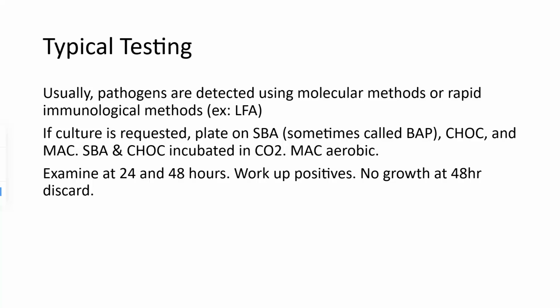Sometimes, though, physicians will order a respiratory culture. And a lot of times, like I mentioned previously, these are going to be sputum cultures, or if a patient has been on a ventilator or an indwelling respiratory device, maybe we'll order something like a swab around that device to check for biofilm formation or to check to see what organisms might be growing in there. Because the longer we have indwelling devices in the body, the more likely we are to develop those types of biofilm infections around those devices.